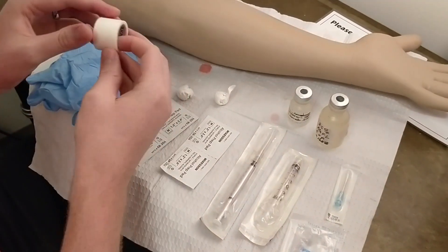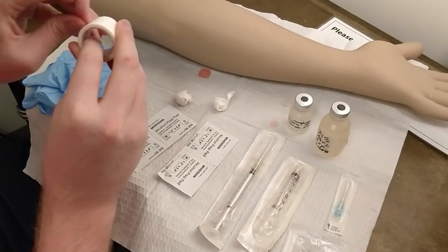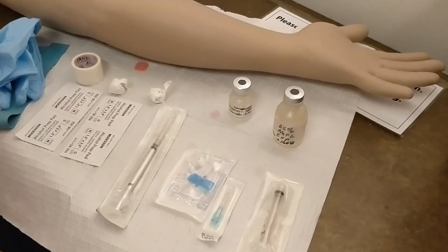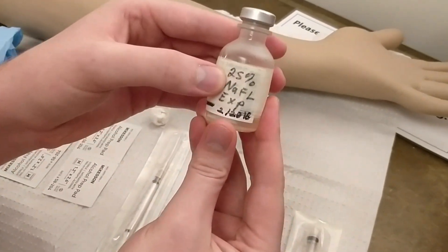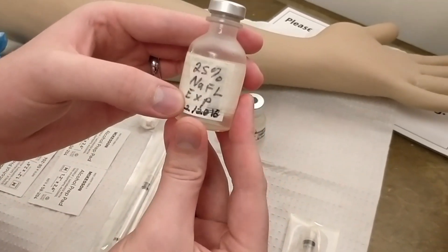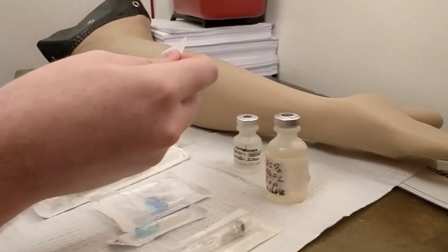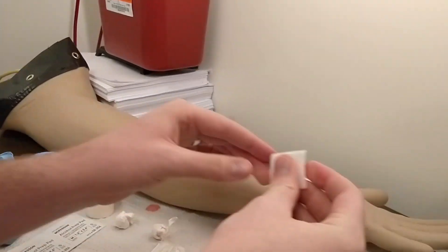One thing I like to do now is go ahead and prep your tape by pulling out the edge — when you wear your gloves it is impossible to get these things started, and it will just help you out in the end. To prep our sodium fluorescein syringe, we are going to first state the concentration, the name of the medication, and the expiration date. In this case: 25% sodium fluorescein, expiring February 2016. Now clean the top of that using an alcohol prep pad with one single swipe.